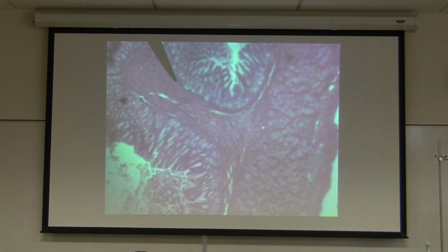Smooth muscle. And what is the name of the tissue? Elastic. Very good. Elastic fiber. Okay. What organ? Stomach. What is the name of the structure? The entire structure. Rugae. That's right. Rugae or rugi, either one. Both spellings, based on the textbook I read once, are correct.